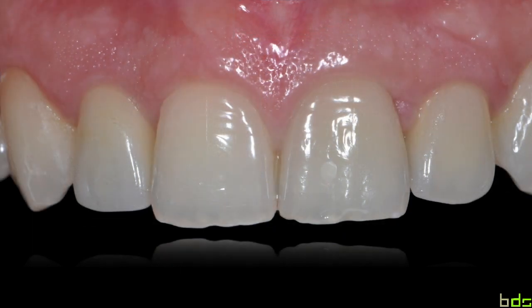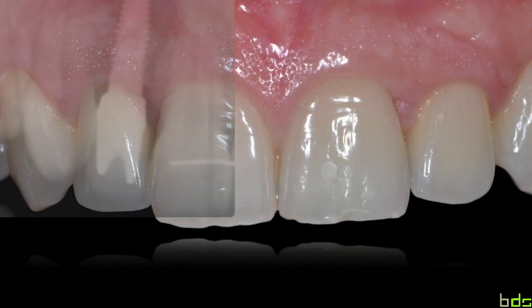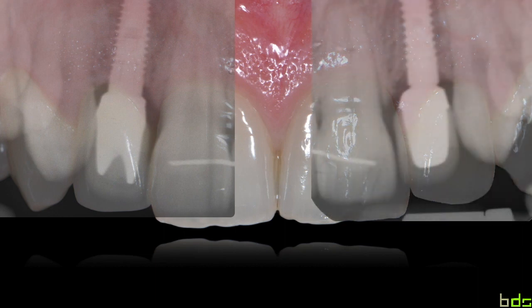Let's see also a case of missing lateral incisors. Both were replaced with 2 implants with distinct macrogeometries. Here, one is a Nobel trilobe internal connection on the right side of the patient, and the other one is a Straumann bone level. Now, one can argue that all these implants were placed in the aesthetic zone, replacing a single tooth, and more or less, the bone peak, or the papilla, is always guided by the adjacent teeth.